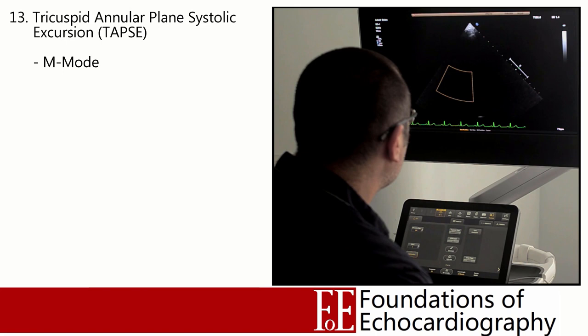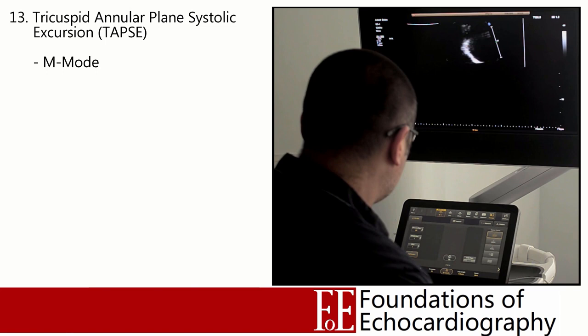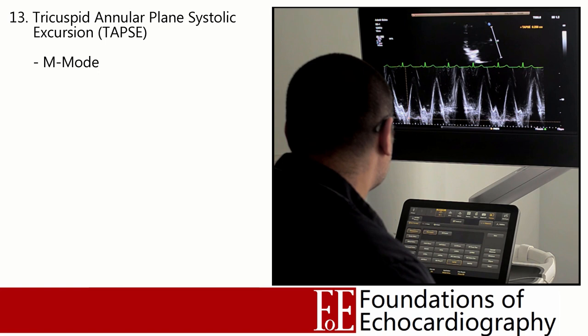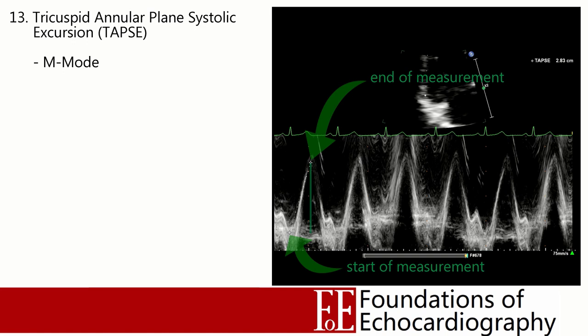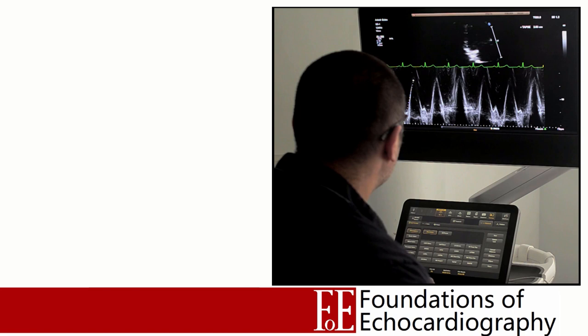A key measurement for assessing right ventricular function is the tricuspid annular plane systolic excursion, or TAPSE — how far the tricuspid annulus is pulled towards the apex during systole. Zoom in on the tricuspid lateral annulus, place the cursor through it and generate an M-mode graph. Identify the line best representing the tricuspid lateral annulus, which moves towards the near field during systole and away during diastole. Measure the y-axis value from trough to peak; the software calculates this automatically. In our model we have a TAPSE of 28mm, well above the lower limit of 17mm — clearly normal.